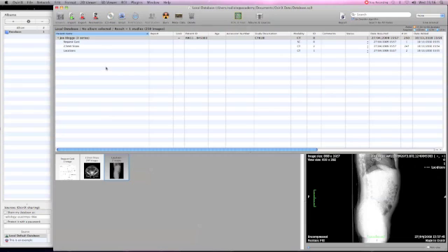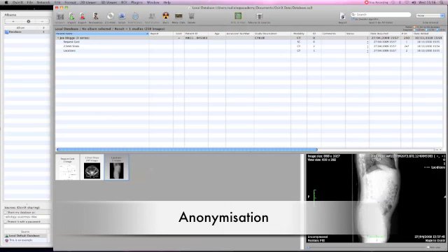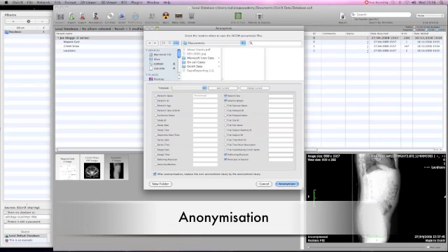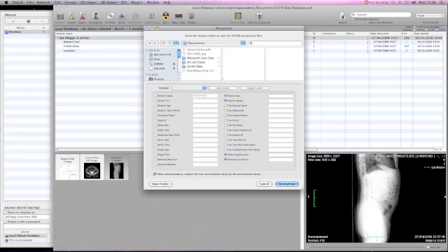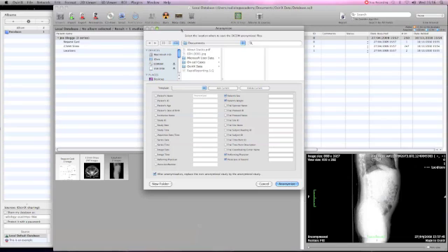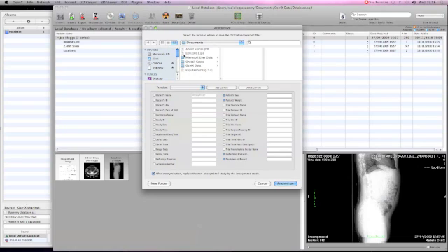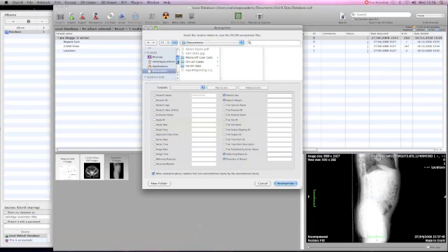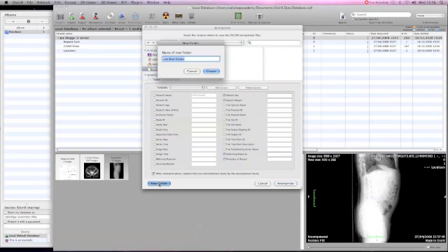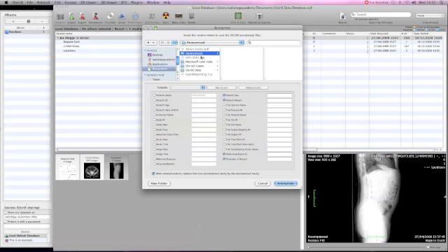Moving on from this, we might wish to anonymize this data, because we obviously don't want anyone else to know this as Mr. Joe Bloggs. If we press on anonymize - we're now in version 3.7, we'll give another explanation for anonymization in 3.8 - we'll see this is the page that comes up. The first thing we need to do is generate a subfolder on the main database to which we'll export our anonymized files. So if we come down to documents, we can generate a new folder which we will title 'anonymized,' and create. Then we will go on to anonymize the data for this patient.